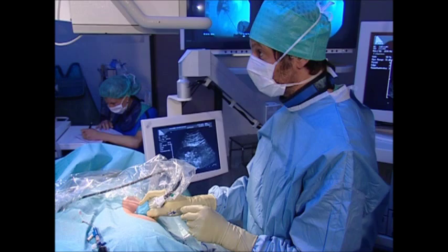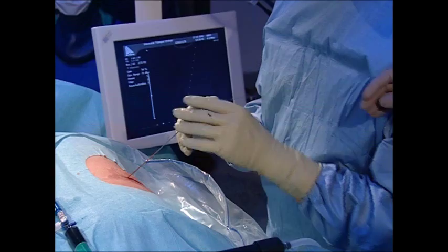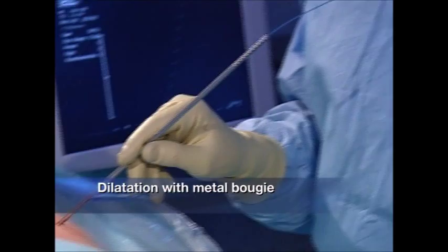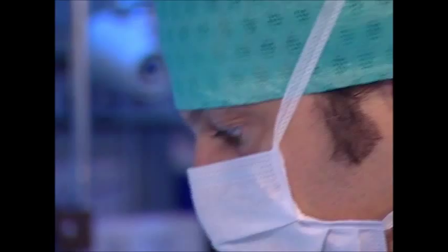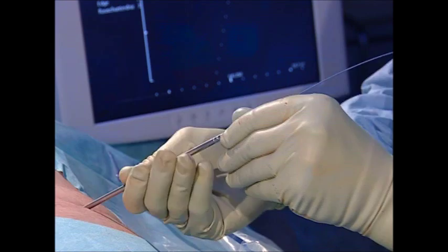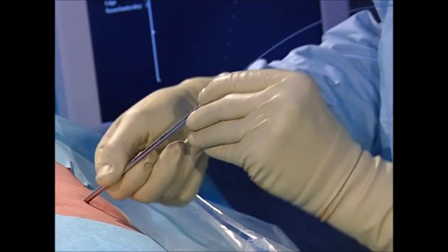After removing the ultrasound probe, a skin incision is made, followed by withdrawing the puncture needle and securing the guide wire at skin level. Under x-ray control, the metal bougie is carefully screwed over the guide wire in the axis of the puncture channel until the renal collecting system is reached. The only situation where a two-step bougie may be necessary is in patients who have previously undergone surgery and who have scarification in the retroperitoneal space.